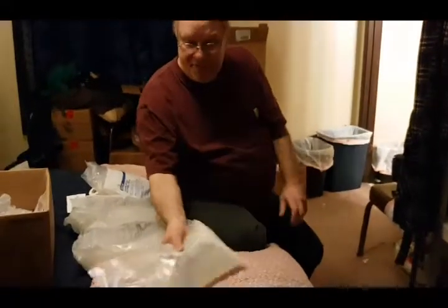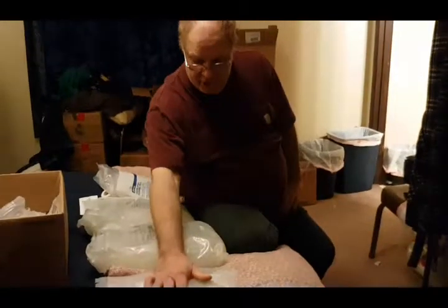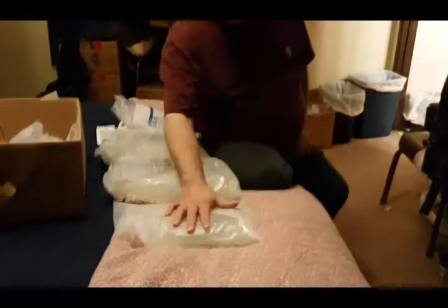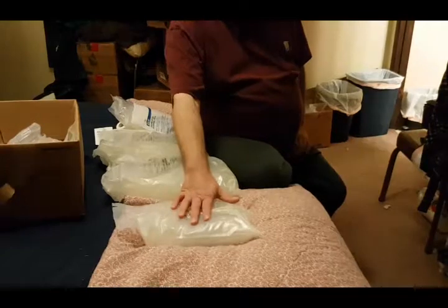Now, this little bag is the last bag that goes in me. This one is extraneal. It's not sugar base, it's cornstarch base. And the idea is, this sits in me all day long, and I do not reabsorb it. Because if this goes to equilibrium with my body, it can be reabsorbed with the waste products. We don't want that. So the last fill is this one.